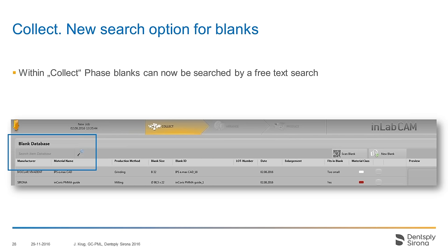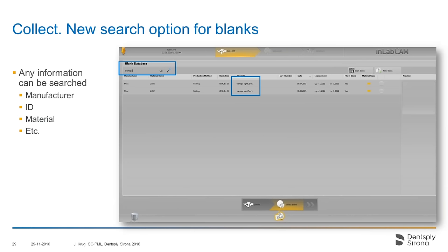We have integrated a free text search in our search window. So if you are searching for a particular puck or block and you have a long list or don't know where it is, you can type in any kind of information — whether it's a manufacturer or the ID of the disk material — and the software will show you a list of potential results based on your entry in the search window.